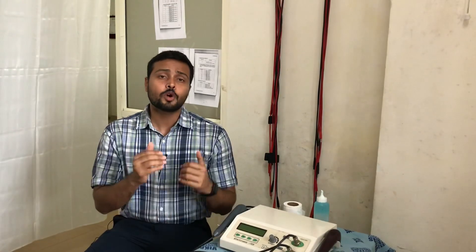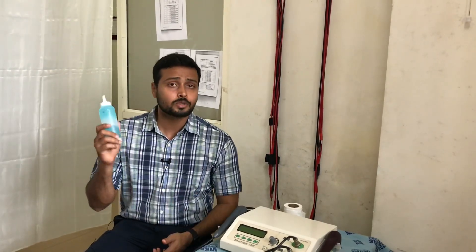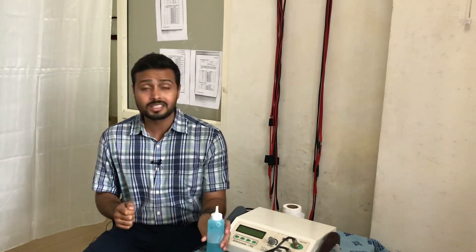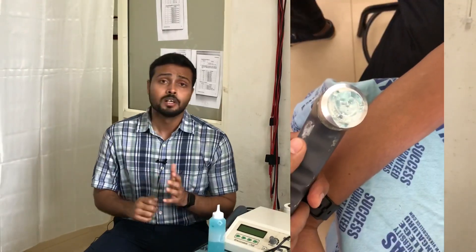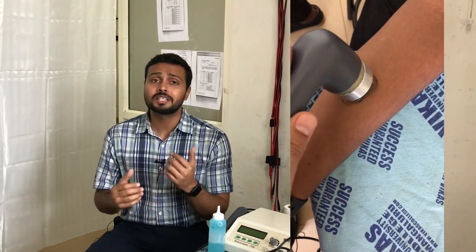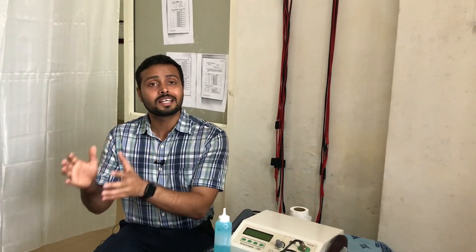The next thing is what medium we are using for giving the ultrasound. Normally we use ultrasonic gel, which provides a good medium for transmitting the waves to the skin. Sometimes if the patient has severe pain and is not allowing direct contact of the ultrasonic head, we can also use the water immersion technique.